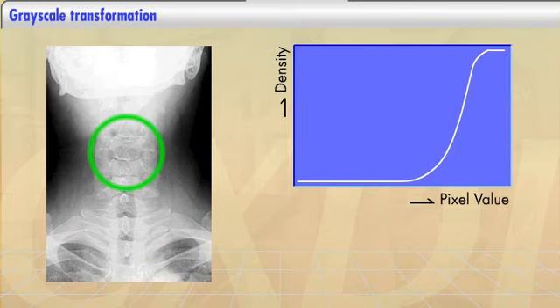The CXDI system determines how to move the S-curve by measuring features in standard grayscale regions for that particular part of the body. The system adjusts to the different densities that are proper for the chest and the cervical spine, for example, by shifting the lookup tables according to the respective features in those areas.